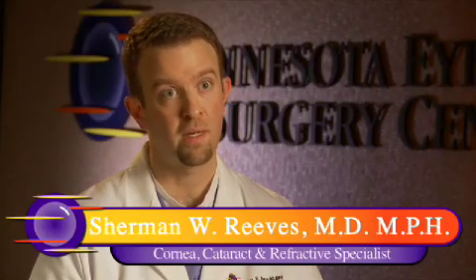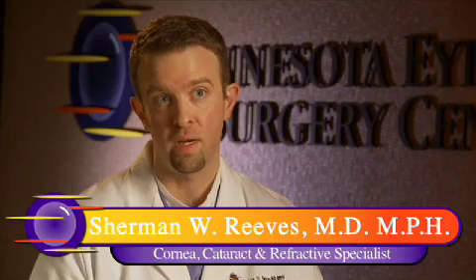LASIK technology has been around since the early 1990s, with the introduction of the excimer laser. It's an extremely precise laser, so precise it can actually chisel your name on a human hair. That laser was a dramatic improvement over the previous way we did refractive surgery, which was for a surgeon to use a scalpel in their hand to make very small incisions in the cornea. You can just imagine how much better a laser is at making incisions than a surgeon. Just with that step forward, the field of refractive surgery took a giant leap forward in outcomes.